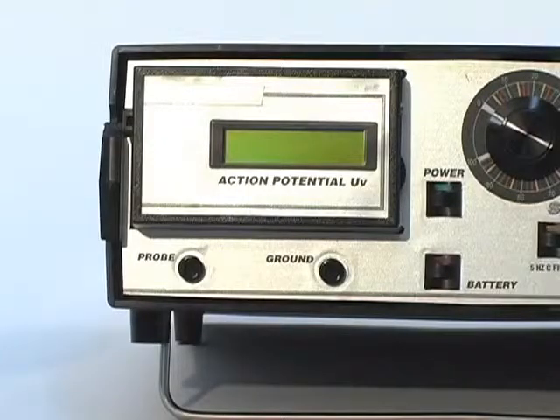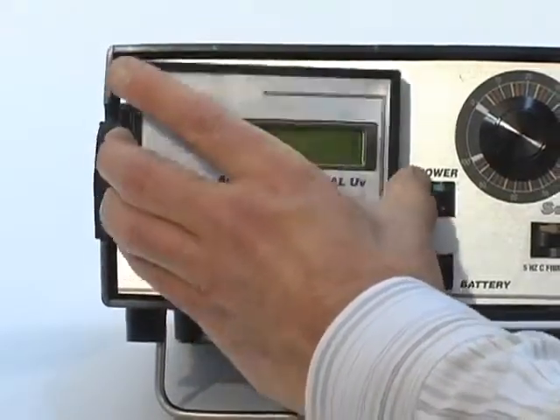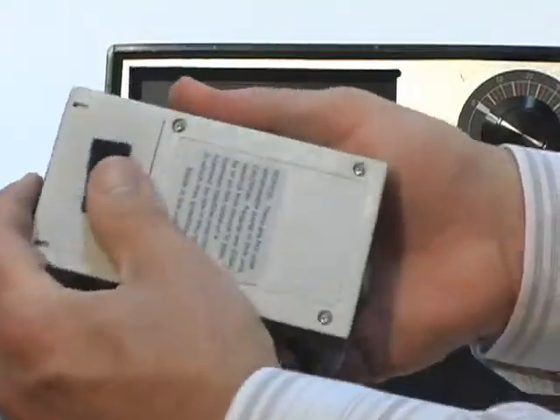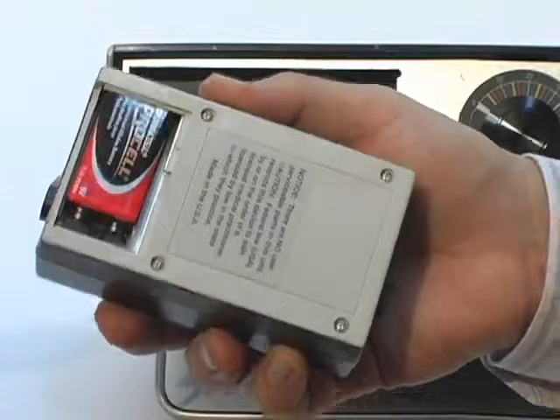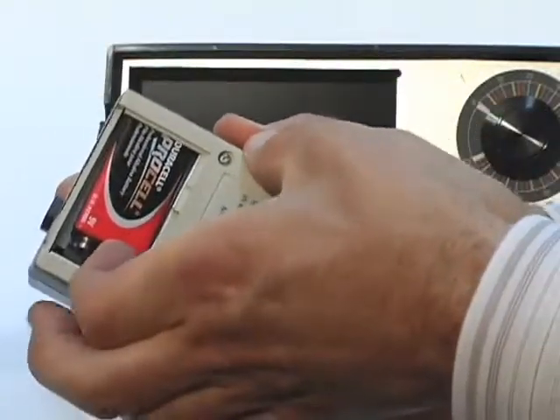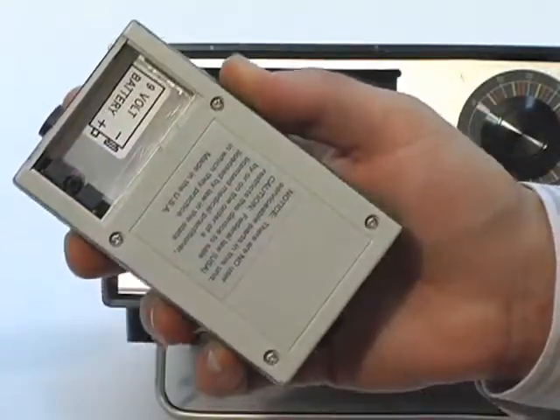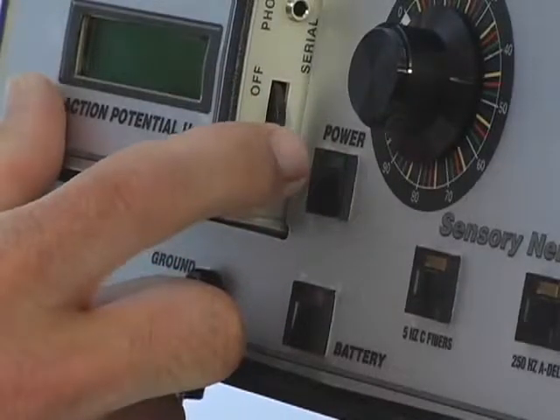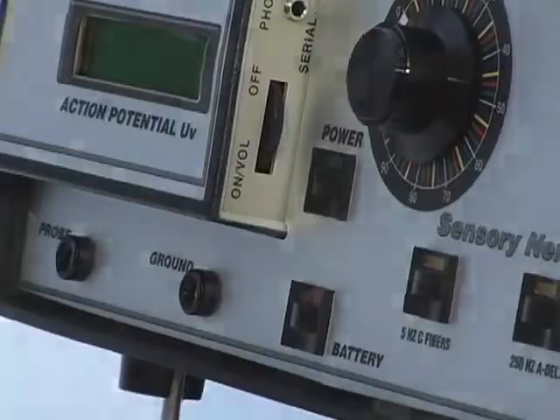The potentiometer has its own battery that may need replacing. Remove the potentiometer from its cradle. The potentiometer is powered by a standard 9-volt battery located in the compartment in the back. Slide open the lid to replace the battery. The knurled dial on the side has a click-off position to save battery life.